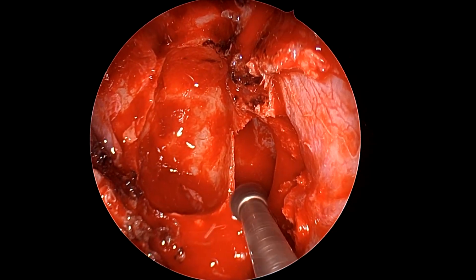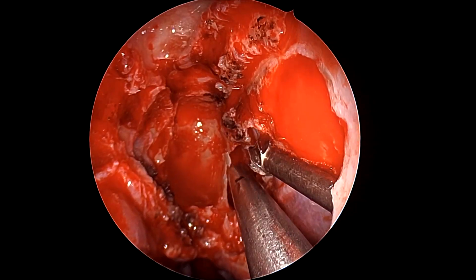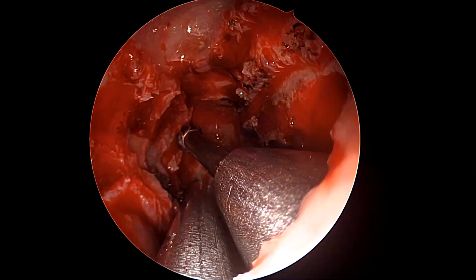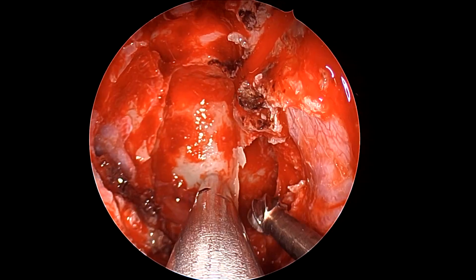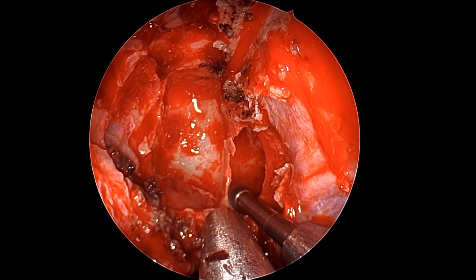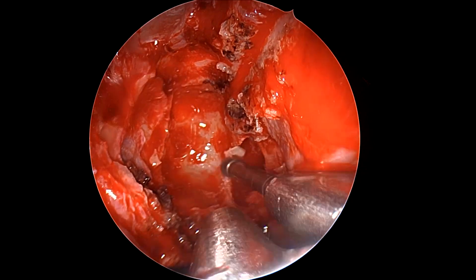And once we can see the intersphenoid septum, we start using a drill to drill the intersphenoid septum. And we don't avulse it ever, because it attaches to the carotid or sometimes to the optic nerve, and it's avoidable. It's straight in this patient, but more or less it always is not. It's never straight. So the use of a drill is strongly recommended.